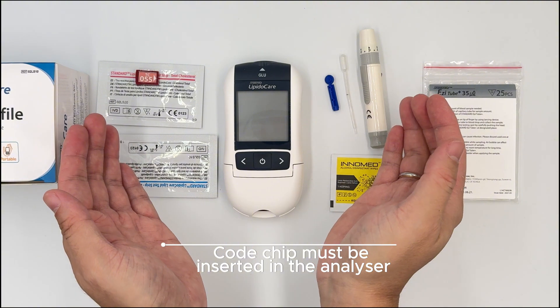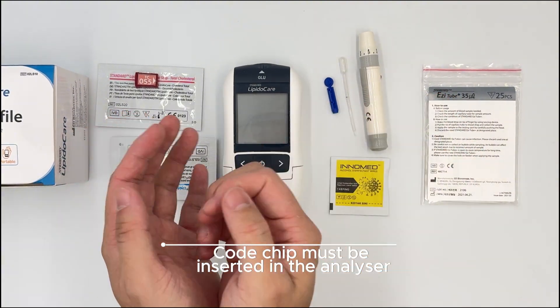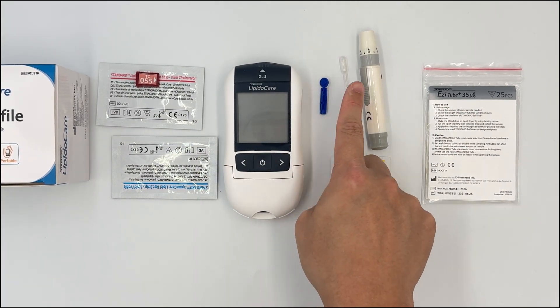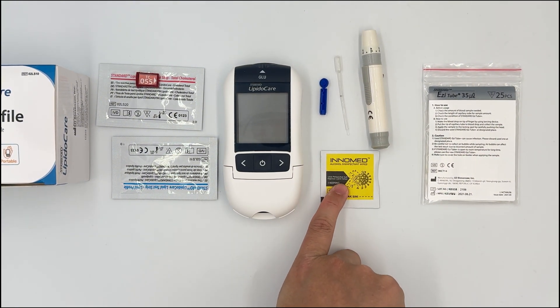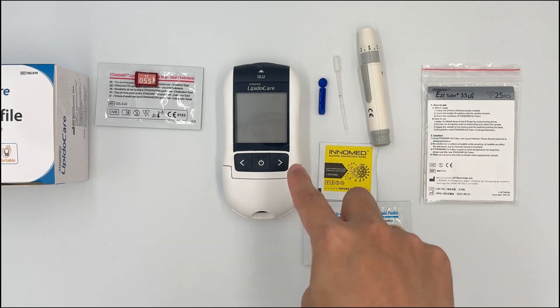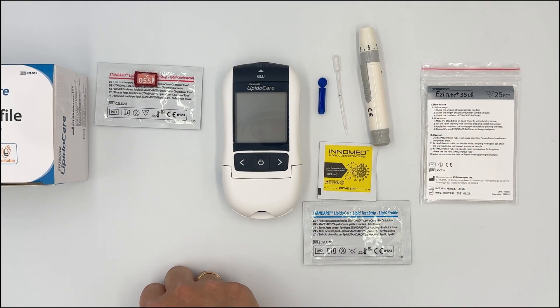Before we do the test, I always like to remember the number six — we have to prepare six items. We have the meter, the lancet, the lancing device, the easy tube for sample collection, the alcohol swab, and the test strip. There are six items to make it easier for you to remember.